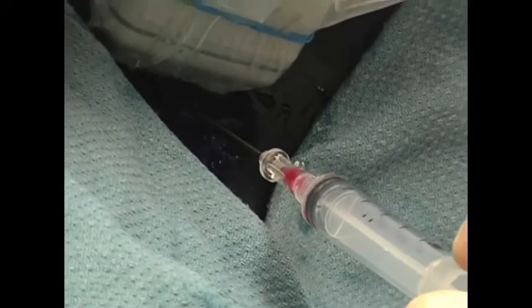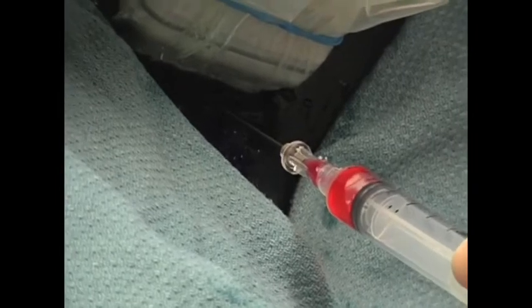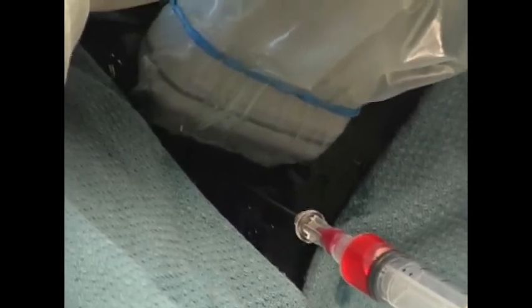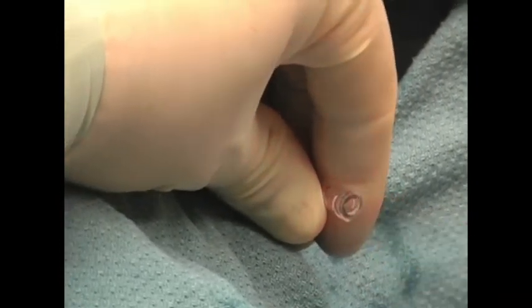Once the needle is in the vessel, aspirate blood into the syringe to verify vessel entry. At this point, have an assistant freeze the image on the ultrasound screen and save it or print it for chart documentation. Now you can lay the transducer across the field, and the line is placed using standard Seldinger technique.